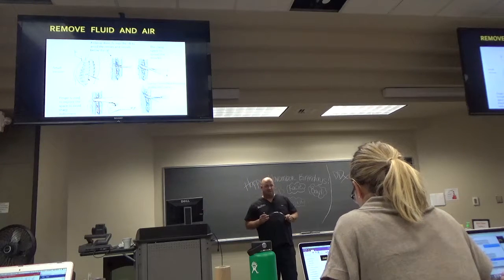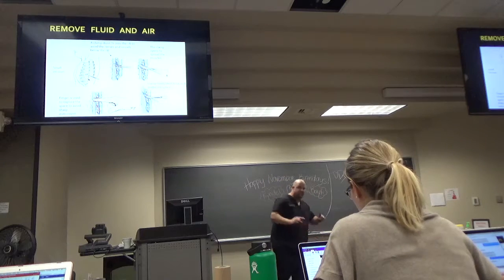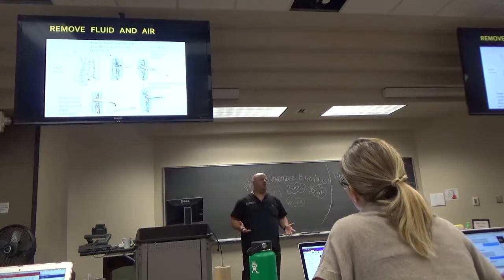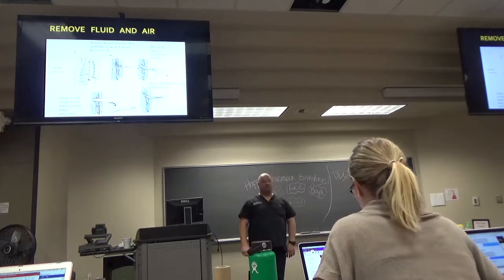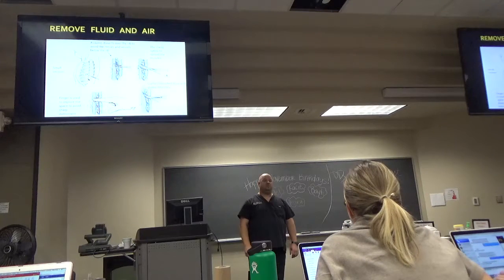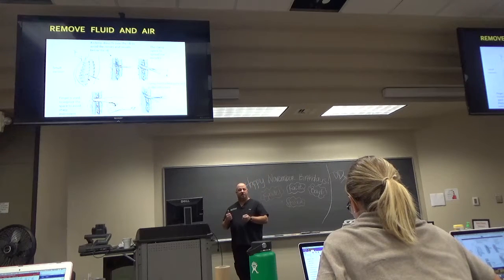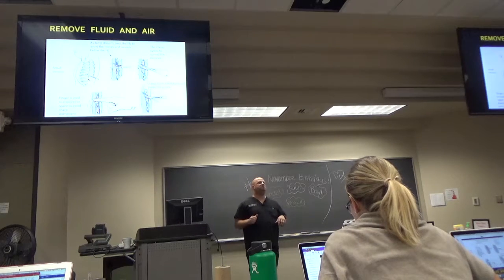The second mistake that people make when they put in a chest tube is our intercostal muscles go in opposite directions, right? Okay? Especially if you get a 90-year-old lady as opposed to some 40-year-old guy or 30-year-old guy who's all muscled up, sometimes it's like poking your finger through a wet paper towel versus trying to stick a knife through, you know, 3-inch thick sheetrock or something. I mean, it's tough, okay? So lots of times we're trying to poke that curved Kelly in the intercostal muscle. Sometimes you're pushing so hard, you're almost pushing them off the table, okay?